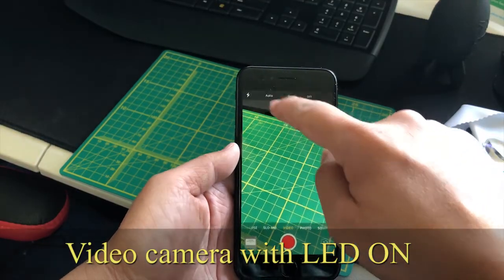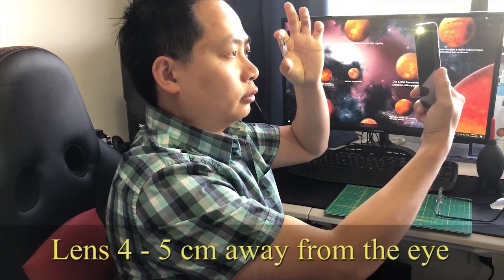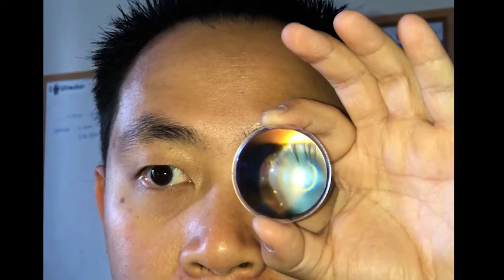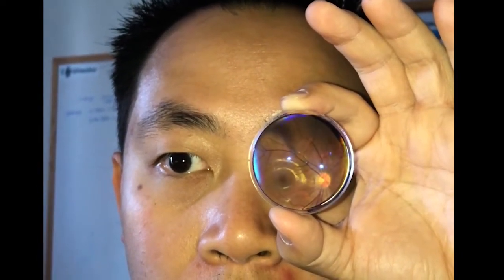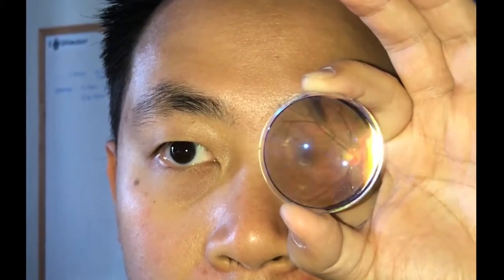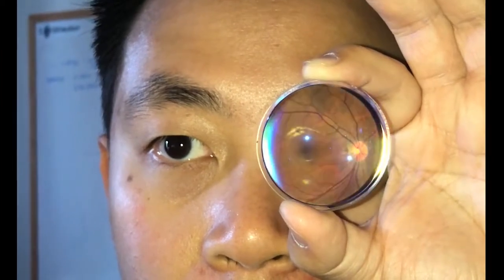It is important to hold the lens in place right in front of the eye you would like to examine, usually about four to five centimeters away from the eye. If you're using a smartphone, hold it at least 15 to 20 centimeters away from the eye. Turn on the light source, make sure it is well aligned to the pupil of the eye, and slowly get it in focus.